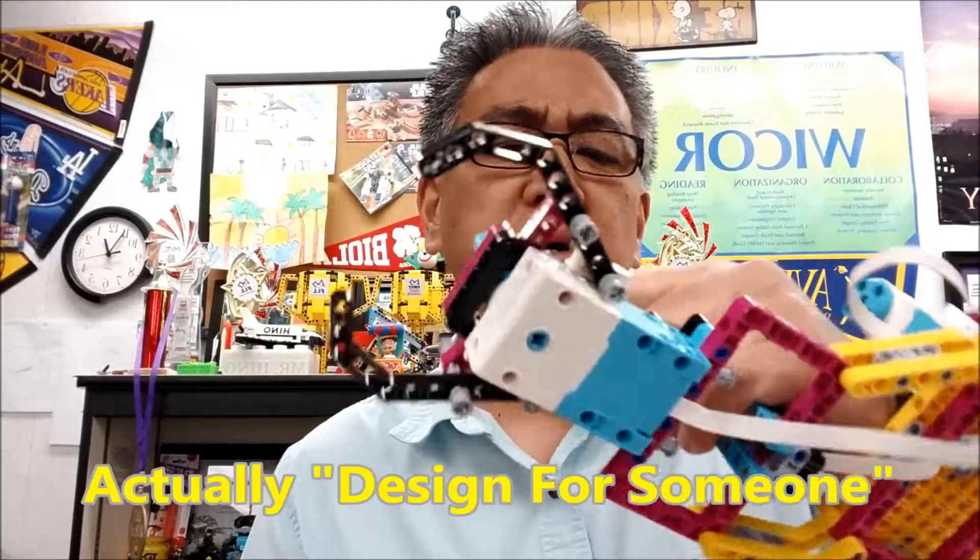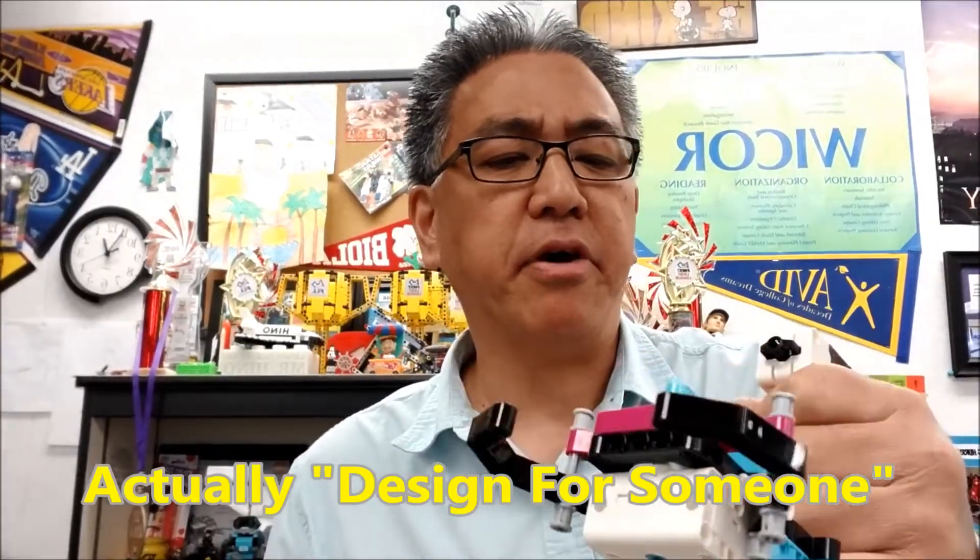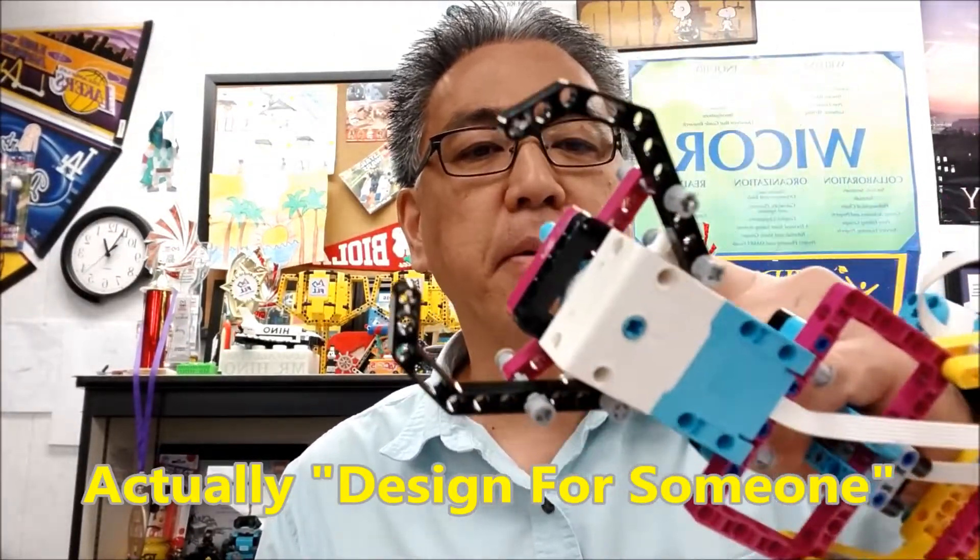What they actually call it is 'Helping Someone,' because somebody that doesn't have an arm can use this as a prosthesis arm. But I like to just call it a robot arm.